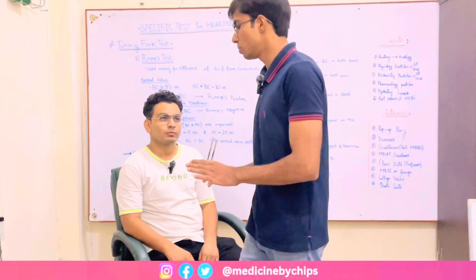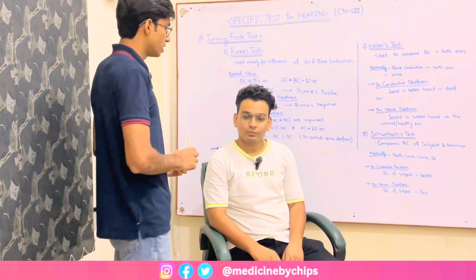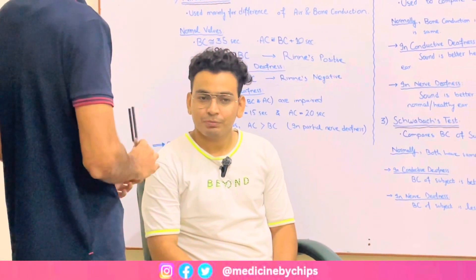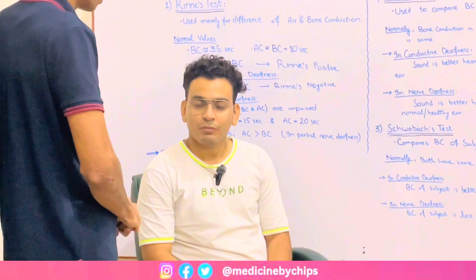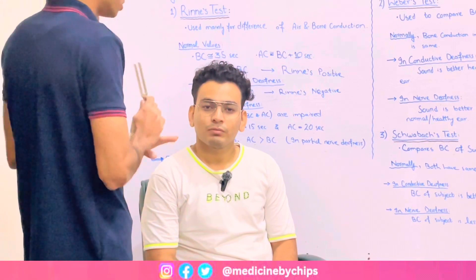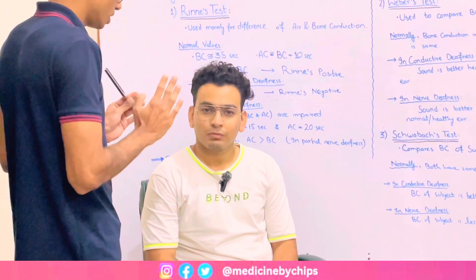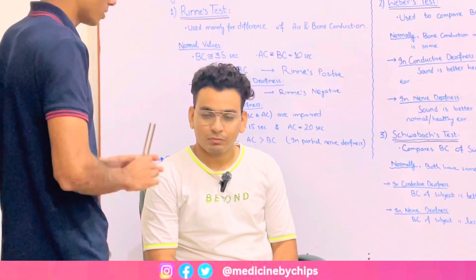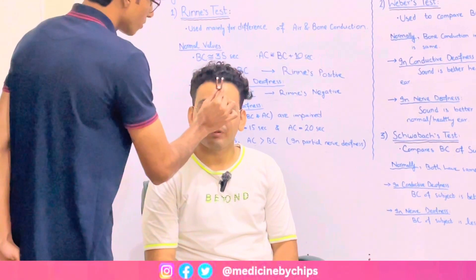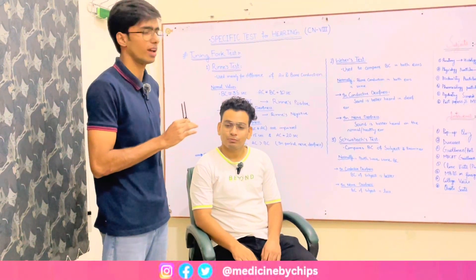I will now demonstrate Weber's test on my subject. The same protocol applies: approach from the right side, offer greetings, take consent, then perform. My name is Dr. Bashir Hasan and I am going to perform your hearing test. I will be placing the tuning fork on your forehead. Tell me whether you hear the sound equally on both sides or better on one side. The subject reports hearing both sides normally, indicating normal bilateral hearing.